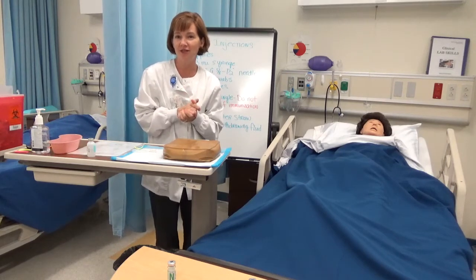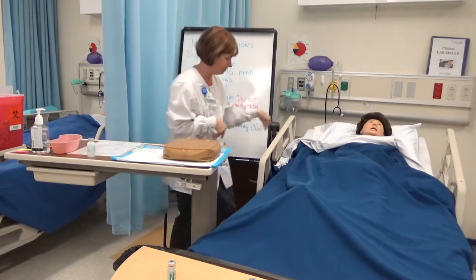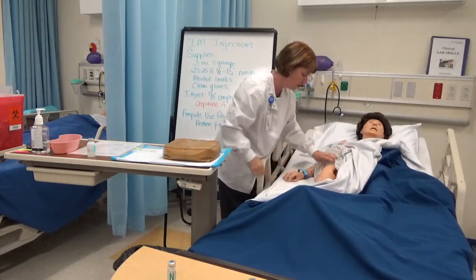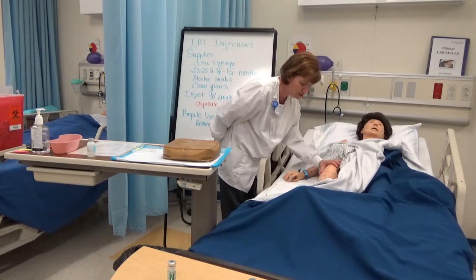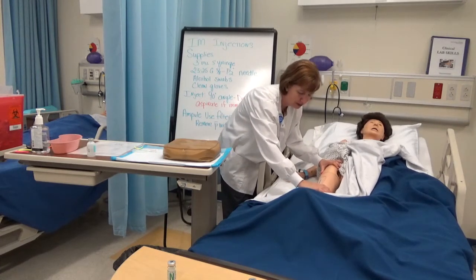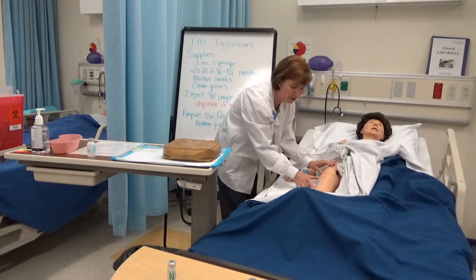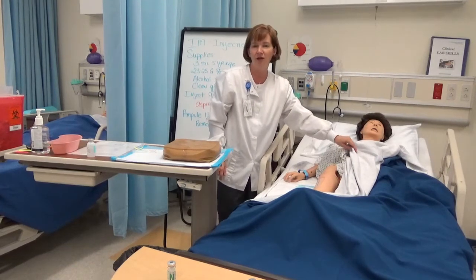Let's do one more site — the vastus lateralis. The placement for that: on your patient, put your palm on the greater trochanter with the thumb facing outwards or down, and your other hand right above the knee with that thumb pointing off to the side upwards. The area for injection is in between your two thumbs and off to the side a bit. That's your vastus lateralis. That concludes our video for IM injection.